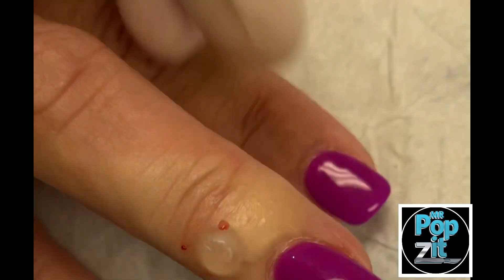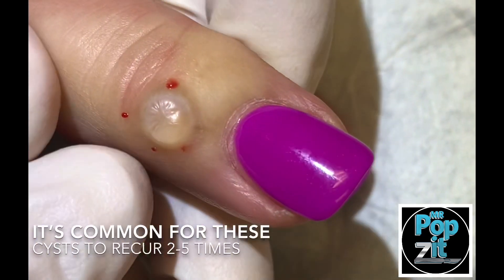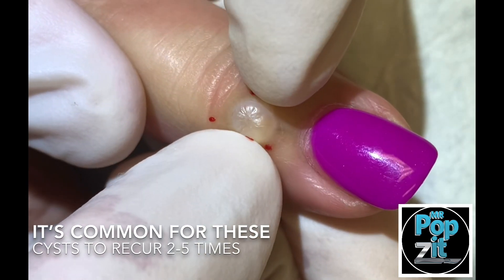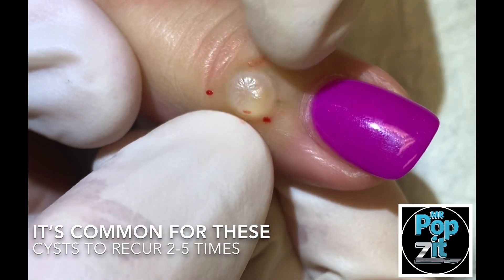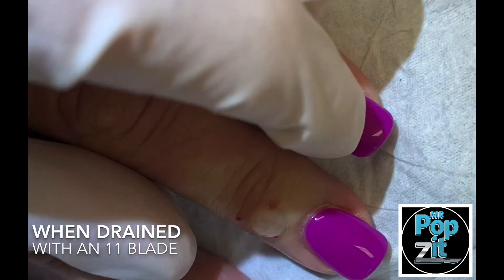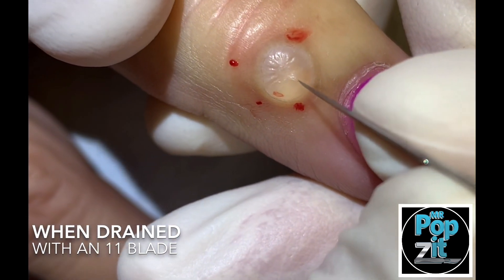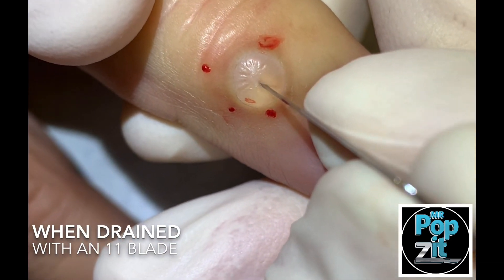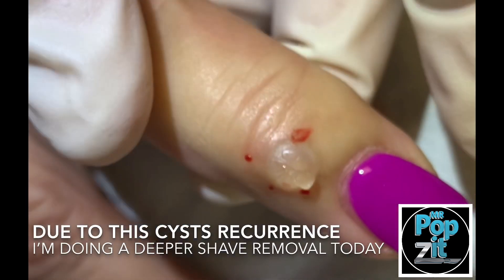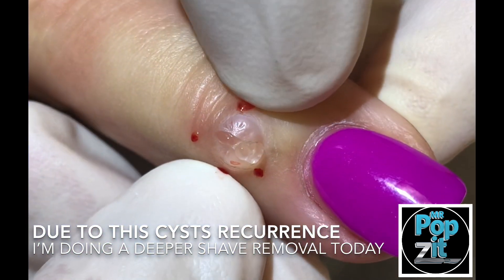We're going to do a little drainage, and sometimes these come back. You want to give me an 11 blade? So a lot of times we can take a little 11 blade and you'll see we're going to get this mucus out, which is a gel that actually lines our joints and that's what helps with moving so it doesn't grind. Now this one has been drained before, and you see we do a little poke here and you're going to see this clear gel come out. It's very viscous.